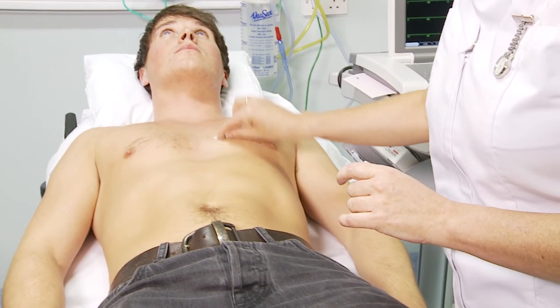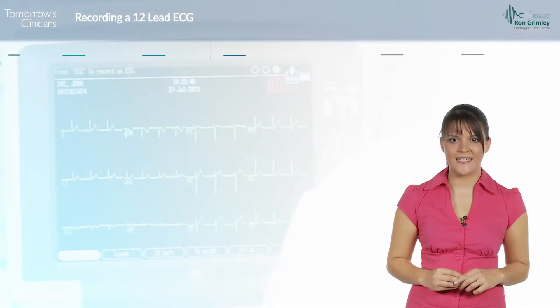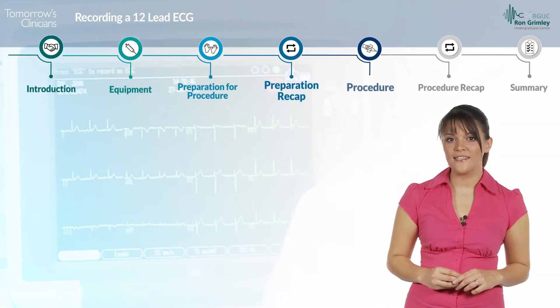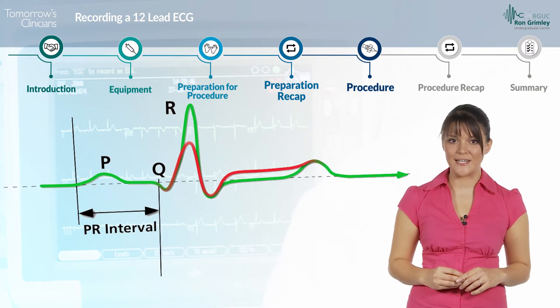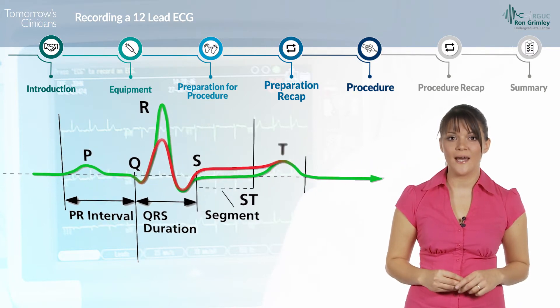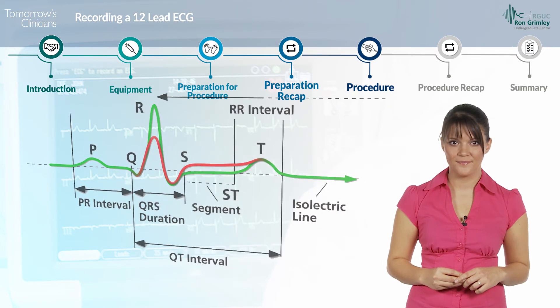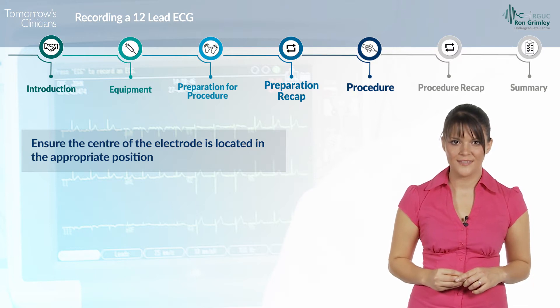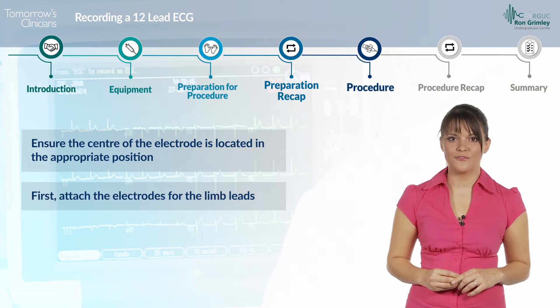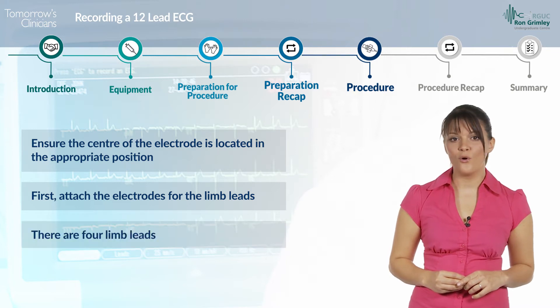Once the skin has been prepared, attach the electrodes and leads. Incorrect placement of the electrodes produces diagnostically significant differences on the ECG, and as a result patients can be treated incorrectly. Ensure the centre of the electrode is located in the appropriate position. First, attach the electrodes for the limb leads. There are four limb leads.